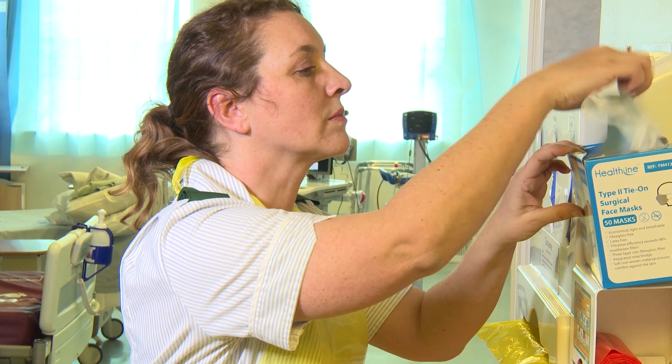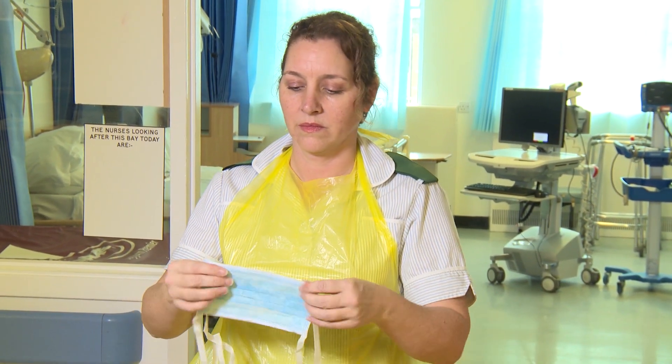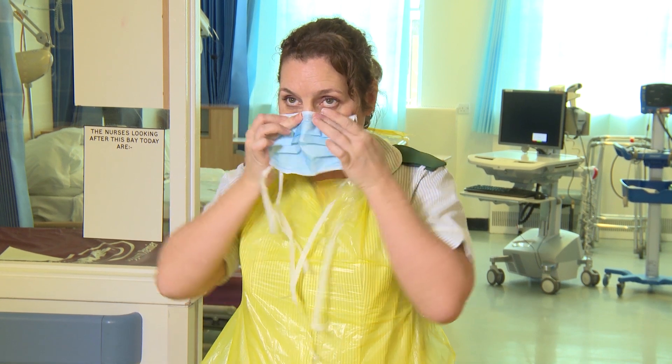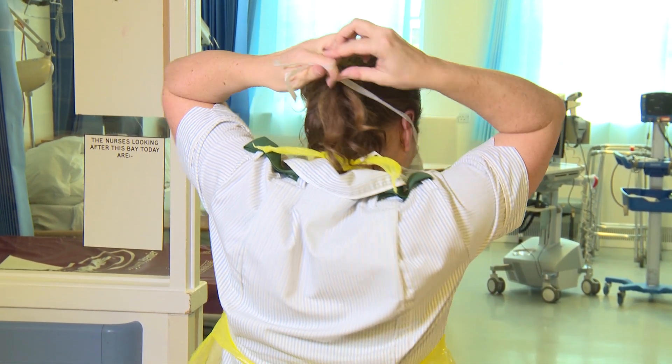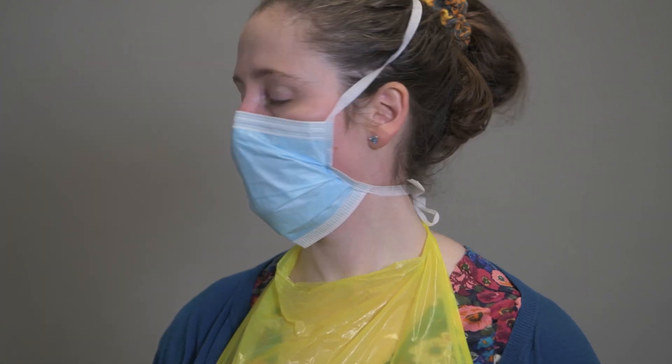Put on fluid resistant surgical face mask. Ensure it is closely fitting and fully covers the nose and mouth. Position the upper straps on the crown of your head, above the ears, and the lower strap at the nape. Ensure mask is flat against the cheeks. With both hands, move the nose piece from the bridge of the nose firmly, pressing down both sides of the nose until you have a good facial fit.